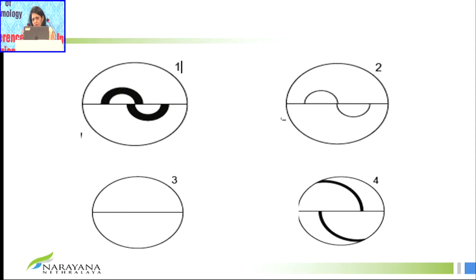Sometimes the patient is not sitting stable. If the height of the slit lamp is not adjusted, then he may be moving backward and forward. And so you see that the mires are not stable, and as you turn the drum, you see that there is no corresponding movement of the semicircles. So then you need to make sure that the patient is sitting correctly and then check the pressures. In the last one, you have moved far too forward, and so then you need to pull the prism back till you see the pulsations and the correct configuration.